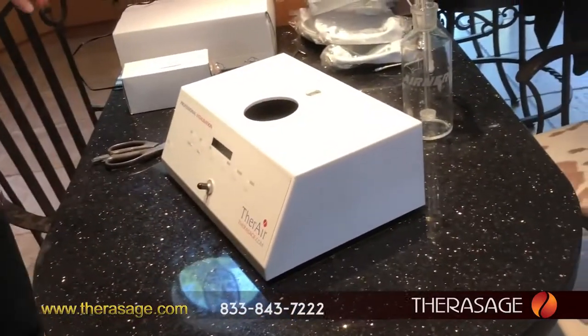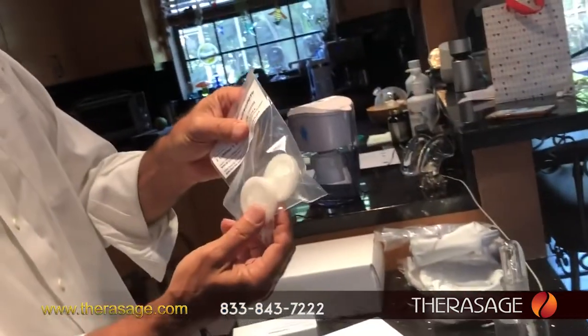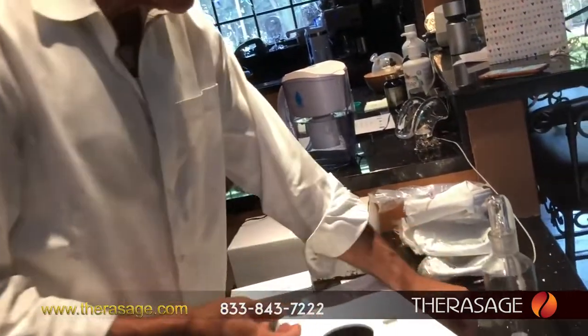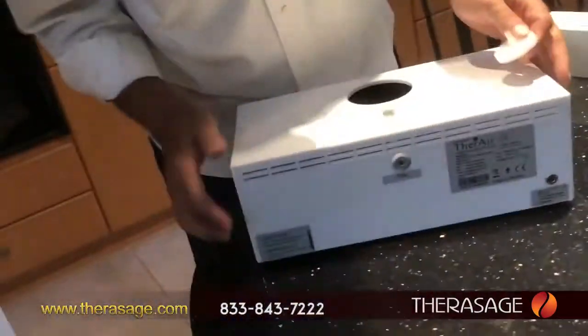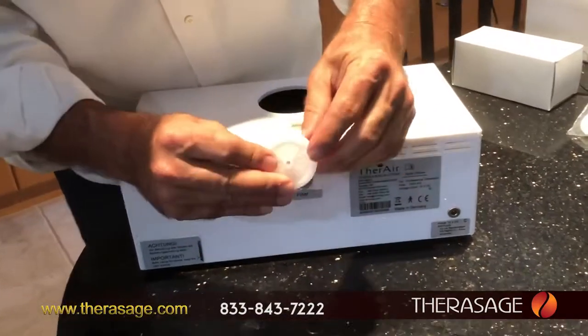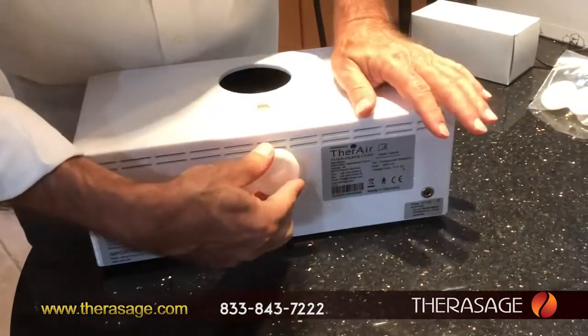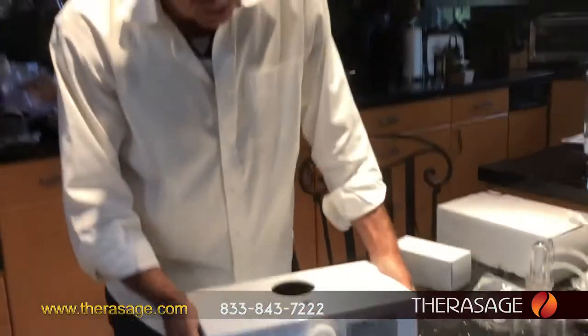The first thing you do is find this little package that has these air filters in it — they look like this. If you turn the unit around, the air filter sits here, this part goes right in there like that, and then you just push it into place. Twist it and push it into place — that's pretty simple.